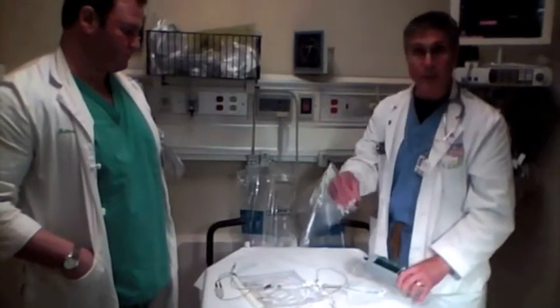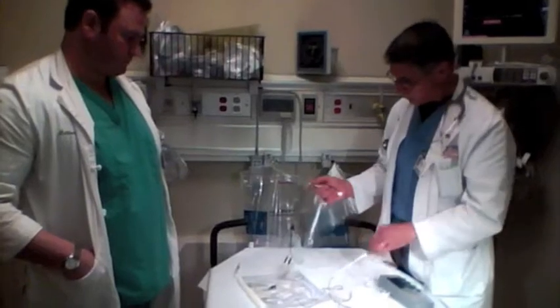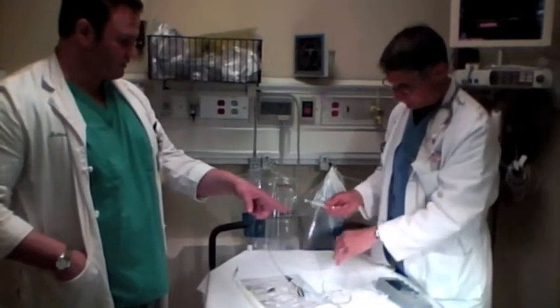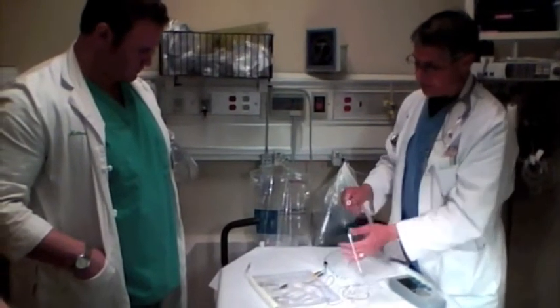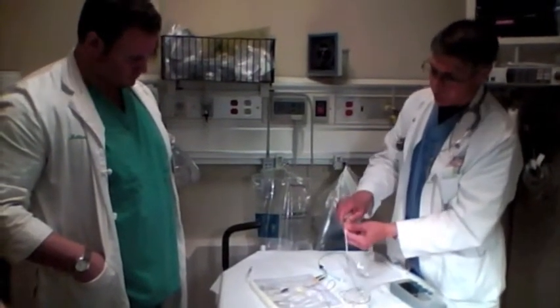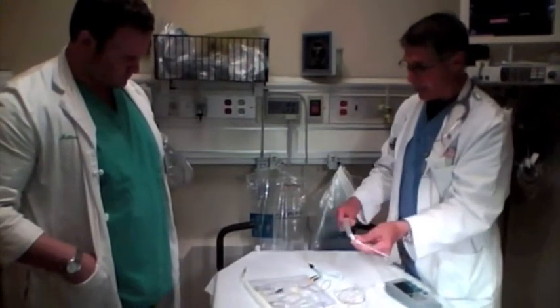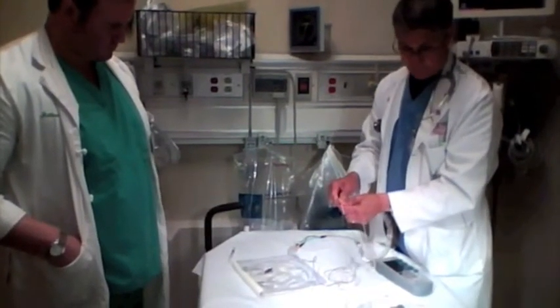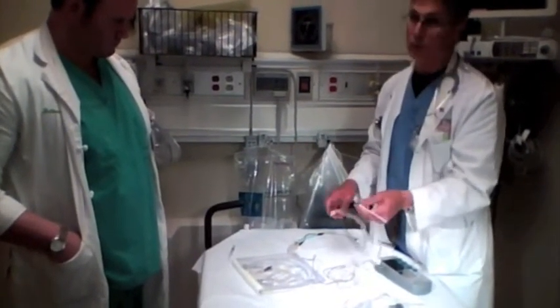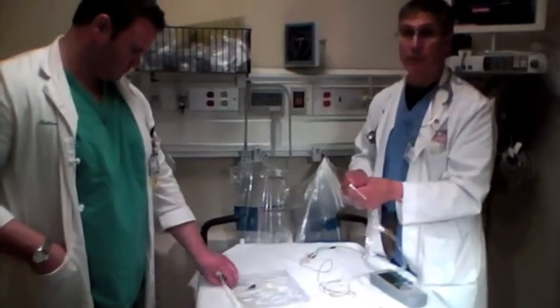The pacemaker is in and capturing. Slide the sleeve over and lock it in position so it can't move. If you need to readjust it slightly later on, you can do so through the sleeve. That's all there is to putting these pacemakers in — it's very straightforward.